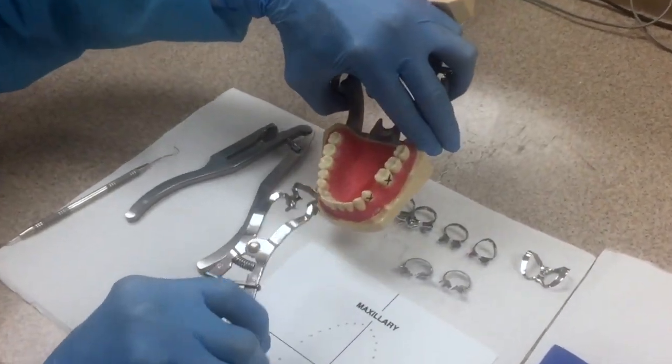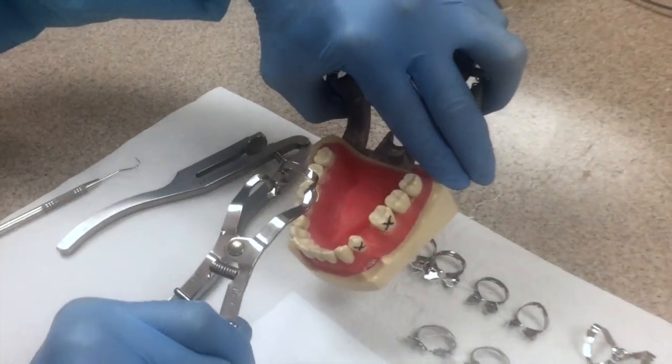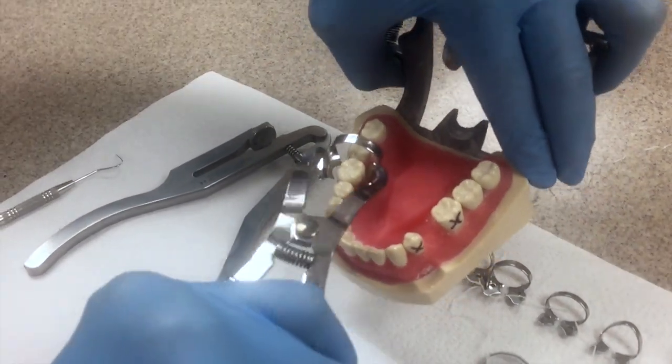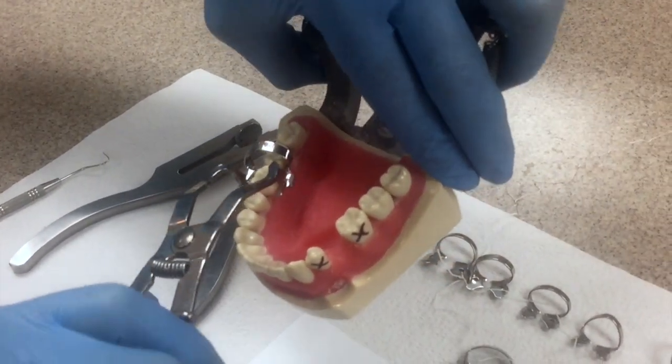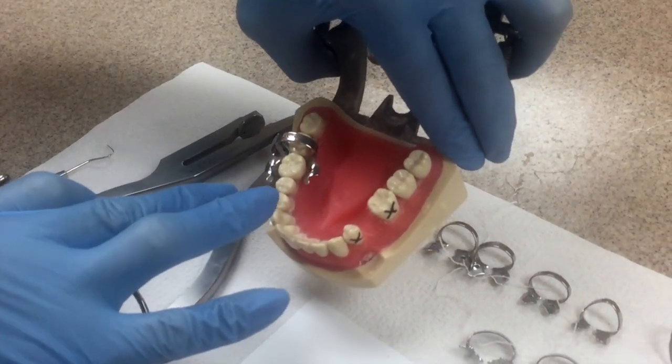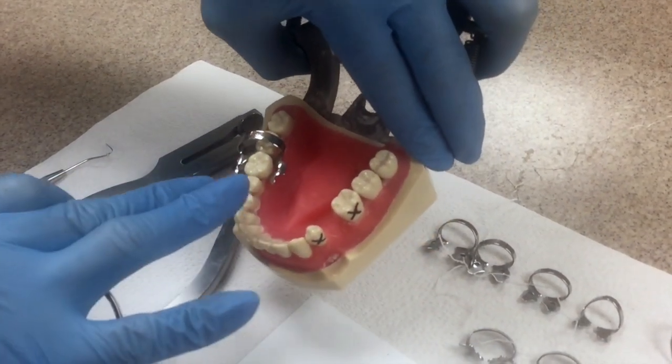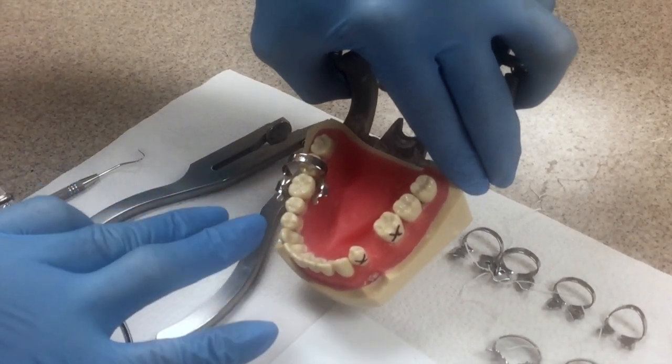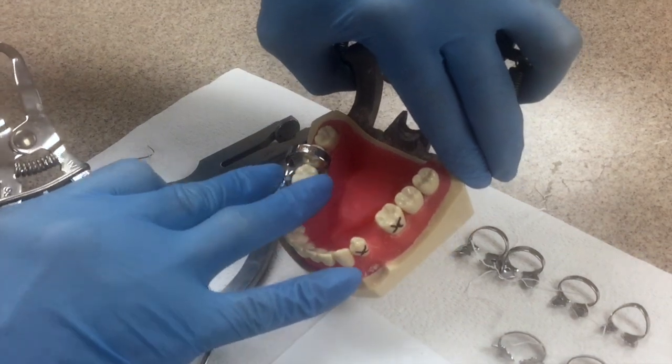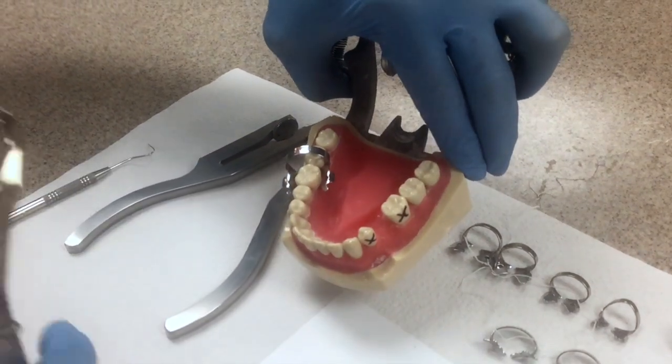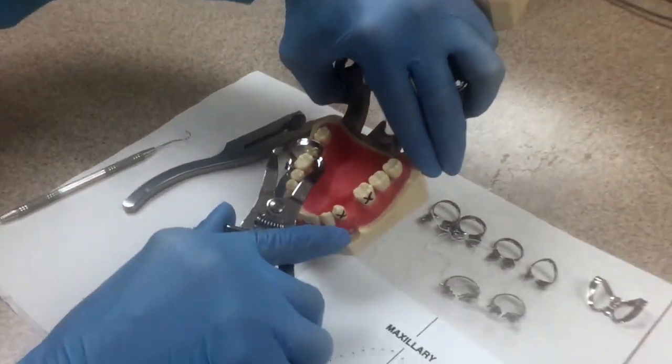Here's our rubber dam. We squeeze the handles together. We put the prongs on the lingual first and then we roll over to the buccal. We always want to make sure that the clamp is going to fit. We hate to assemble all of this in the patient's mouth with the rubber dam attached and then the clamp flies off. So we wiggle it with our fingers to make sure it's not going to come off.